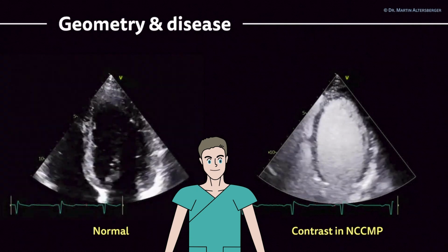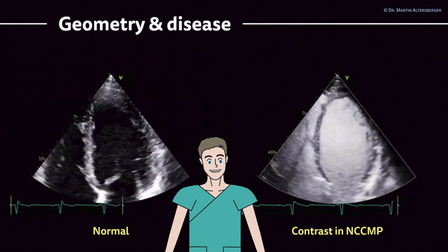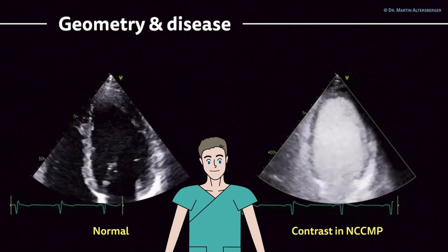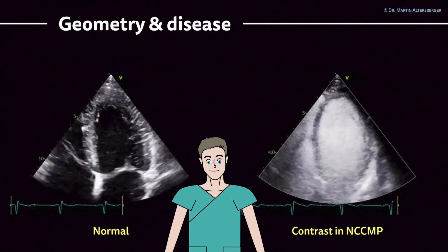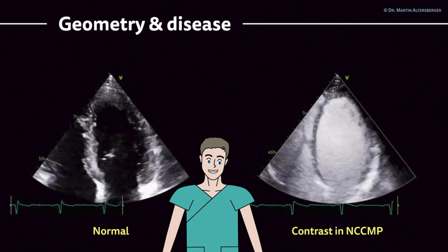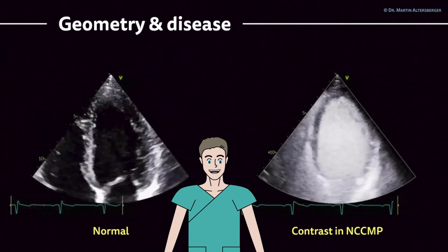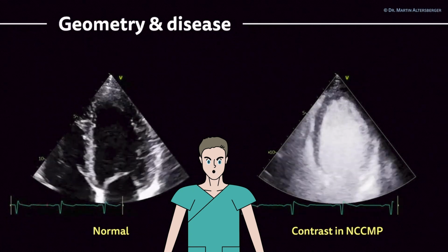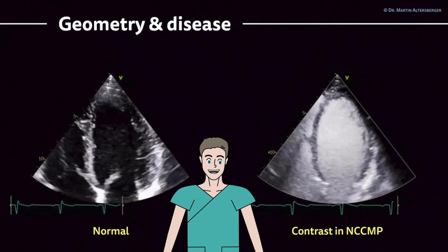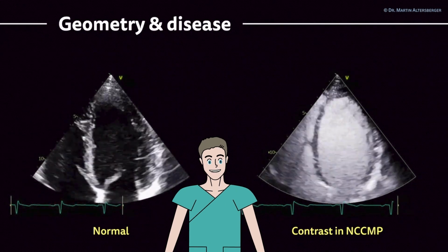Moving on to something I truly like to perform, it's contrast. Contrast imaging gives a lot of detailed information about the heart. And in this case, the patient was a very young patient with formerly known cardiomyopathy known as non-compaction cardiomyopathy. Nowadays we call it hypertrabeculation of the left ventricle with heart failure. Her strain was reduced. Initially, ejection fraction was in the range of 20%, but with heart failure therapy, it improved significantly, as you can see here. In this case, it's around 45%.